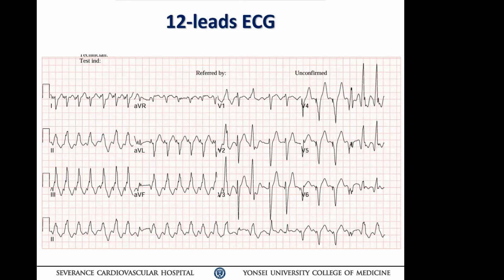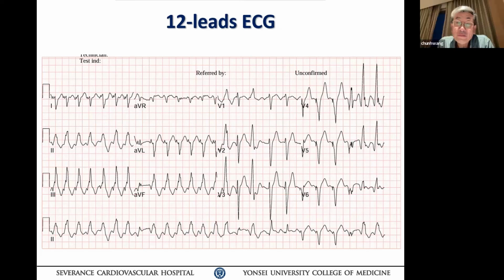So not only the ECG interpretation, because the fellows already read it and pointed out the important points, but I prefer this patient has, I don't know if it's sinus tachycardia or atrial tachycardia. Atrial rhythm is fast, but the ventricle also has a wide QRS complex ventricular tachycardia. And the location is likely the basal anteroseptum, as Washington mentioned. That's my thoughts. So Dr. Bach, what is the mechanism of QRS getting narrower? If this is a VT, then what's the mechanism of the narrowing complex? I think that's important to teach the fellows.